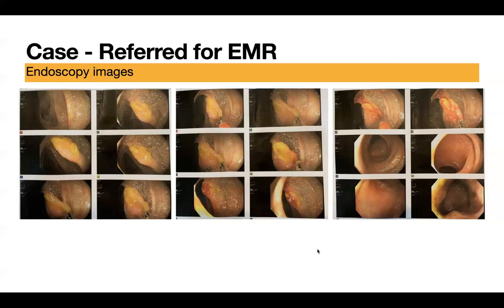This is something we don't see here. I'm wondering whether the endoscopist, when he put in the report that he struggled through the left colon, maybe he was slipping in and out, and he felt that he reached the cecum, but he didn't have time to take a picture and document it. That's possible. But otherwise, when somebody is reviewing your record, the only way to convince them that you did reach the cecum is to take multiple images.